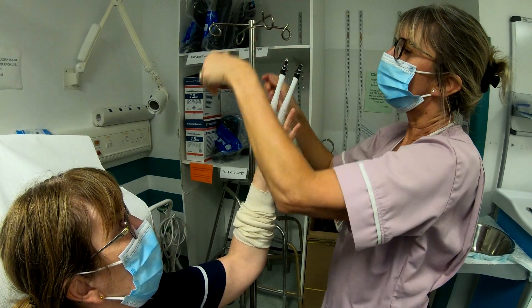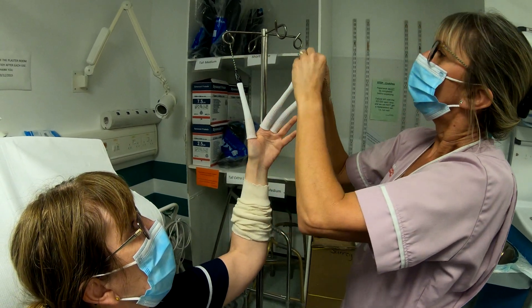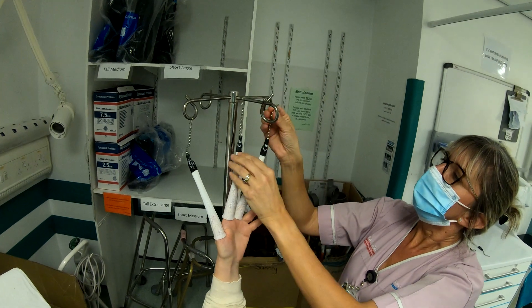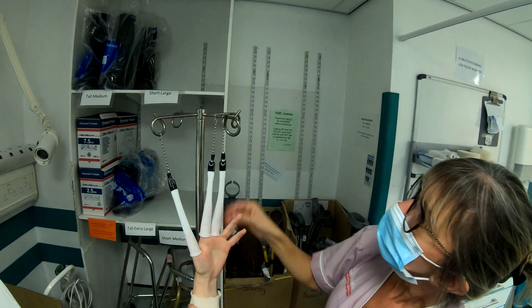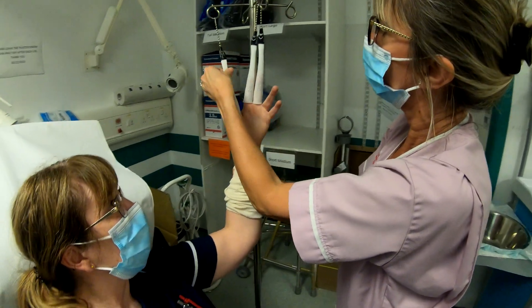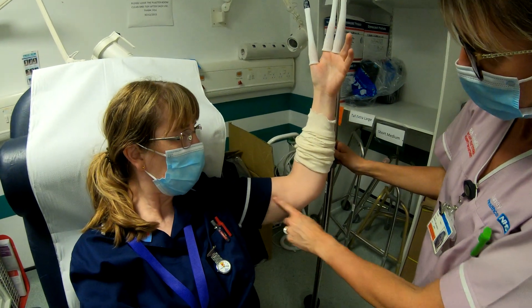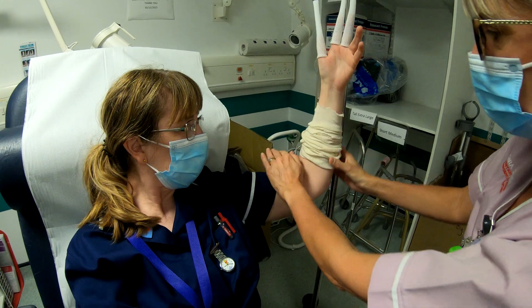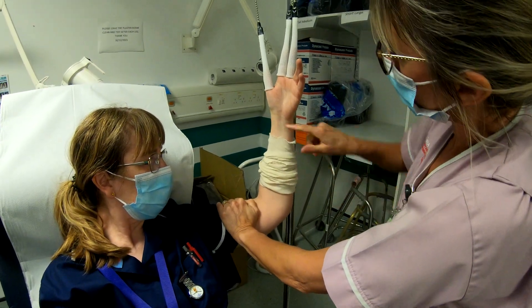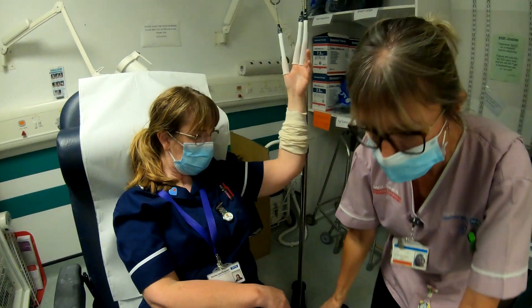Because we've got the four prongs on the drip stand, you can either slide the finger traps on or push them over the top of the bar. We'll put these two on the same bar to get equal traction — they're all nice and taut, which is what you want. We want the elbow at a nice 90 degrees so we can rest the weights on the humeral bone to get equal traction. I've also brought my patient to the edge of the couch so the weights will hang on better.